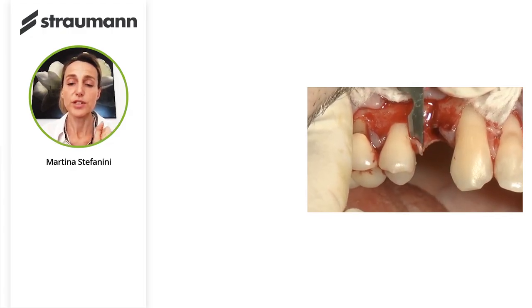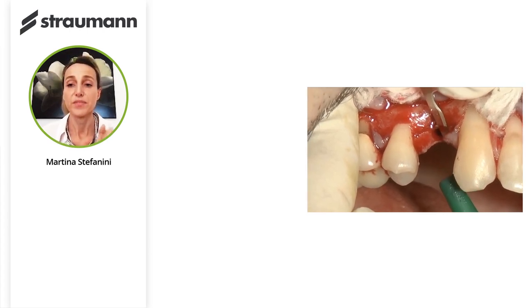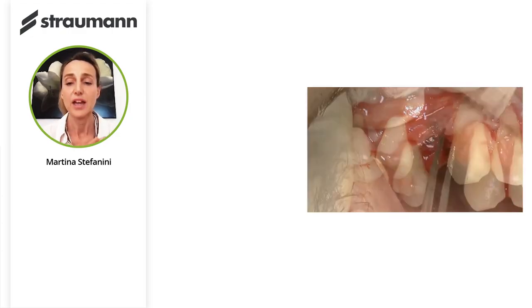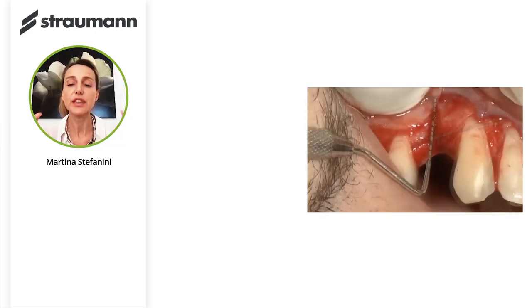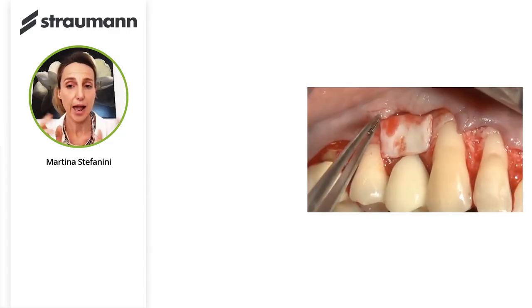Another important advantage of the guided implant procedure in this case is that you can prepare a provisional restoration that can be just realigned intraoperatively and placed in a very easy way. This is the desepithelialization of the anatomical papilla. You can see in this area, since it was a delayed implant placement, we have these two big and nice anatomical papilla that can be desepithelized.